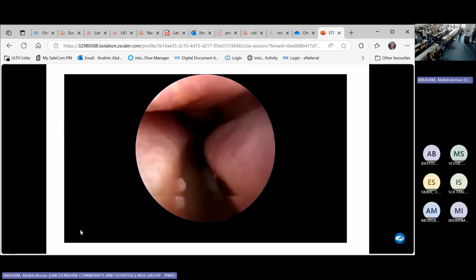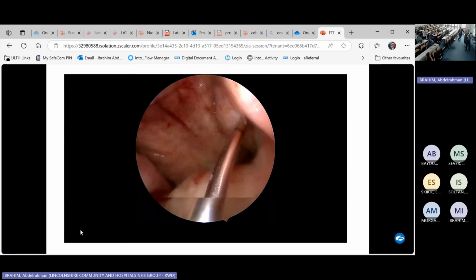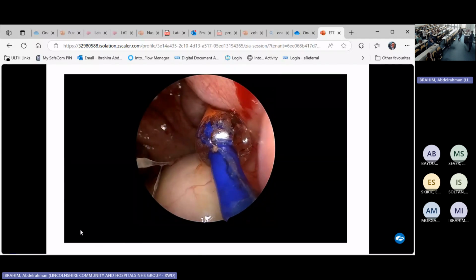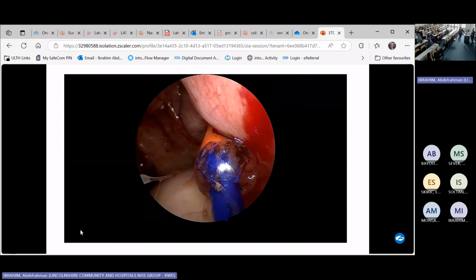Again, outfracture of the inferior turbinate. Find the axilla, I hang it on the axilla, feel it, push the cushions, and then push my guide wire easily. And then put the balloon in again, 2 minutes. Try to be atraumatic to the turbinate as much as possible. If you're doing any work in the nose, try to do it with less bleeding, so it becomes an easier operation for you to do the balloon. If there's loads of bleeding around and you're washing and putting patties to decrease the bleeding, it becomes more and more difficult for you.